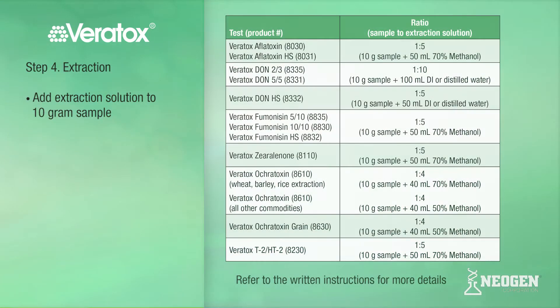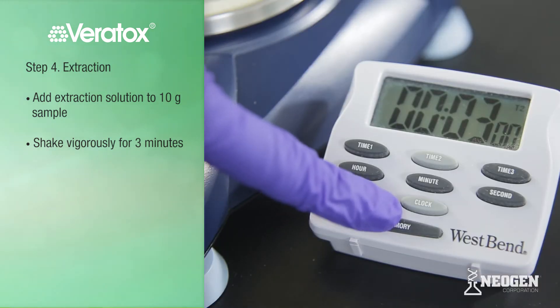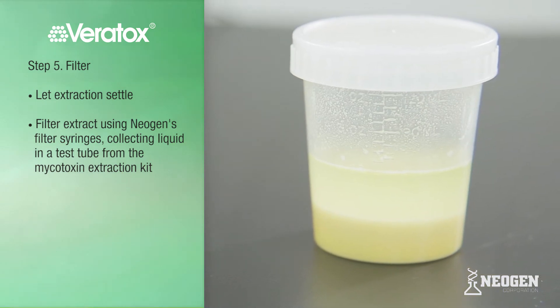DON samples will be extracted in deionized or distilled water. Ocratoxin is extracted in either 50% or 70% methanol, and all others utilize a 70% methanol solution. Using the chart provided, add the correct volume of your extraction solution to your 10-gram sample. For the Veritox Aflatoxin extraction, we will add 50 milliliters of 70% methanol to our 10-gram sample. Place the extraction cup on the rocket shaker and shake for three minutes. The alternative is to shake vigorously by hand for three minutes. Once you are finished shaking, let it settle.